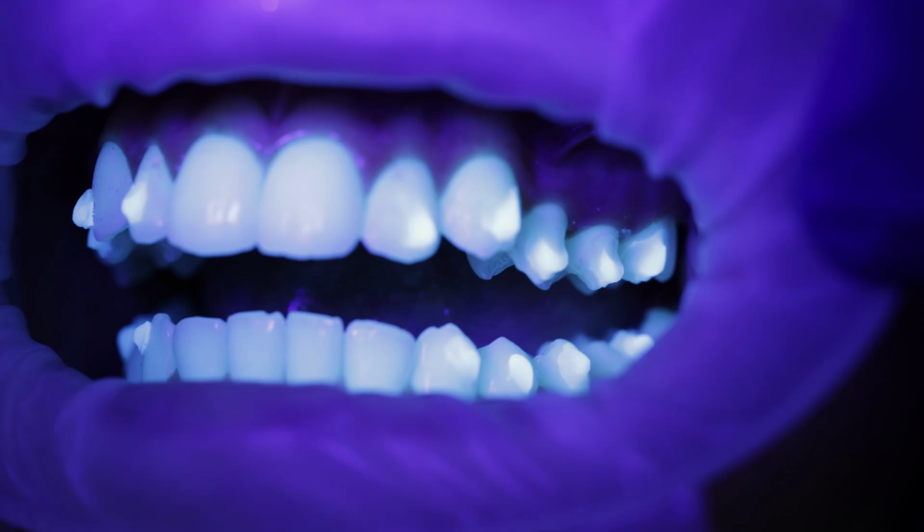The beauty of Tetric Evo is the fact that we can shine a light at any given time. When a patient comes in for us to deliver the next series of aligners, I will basically shine the light in the patient's mouth to make sure that they didn't lose any. Now, the one thing that we told you was that Tetric Evo is clear, it's translucent, and there will be times that patients may not even know that they lost an attachment. This is why this is so critical.